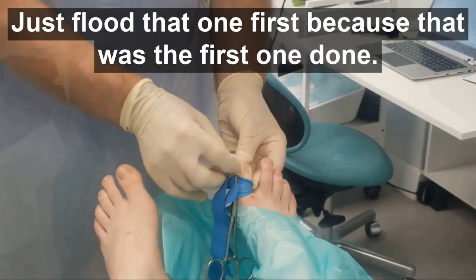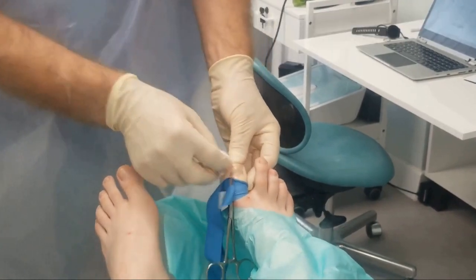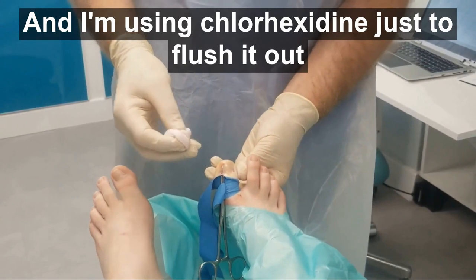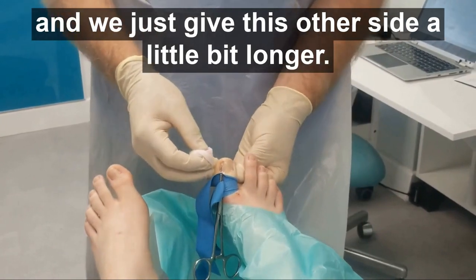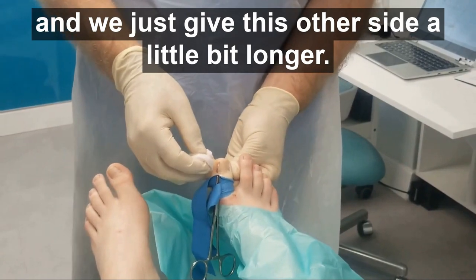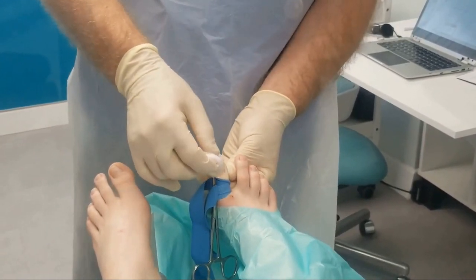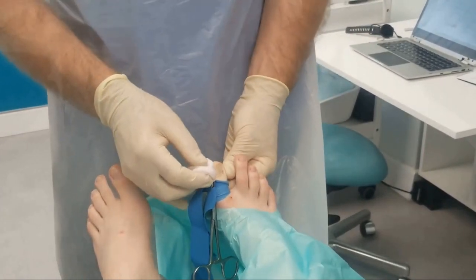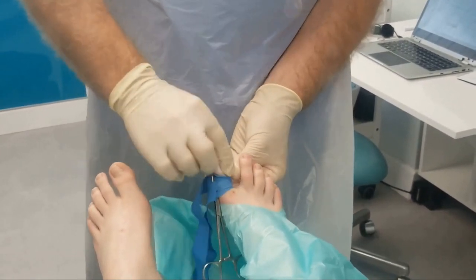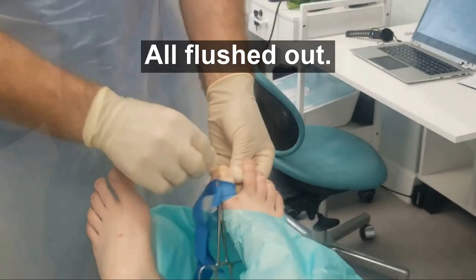Flood that one first because that was the first one done — I'm using chlorhexidine just to flush it out, and just give this other side a little bit longer. And there we go — all flushed out.